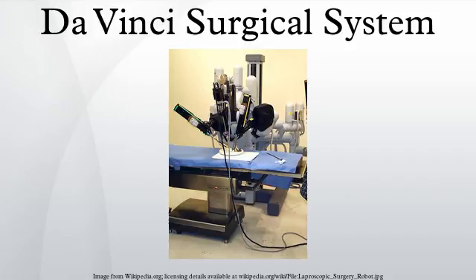Future applications. Although the general term robotic surgery is often used to refer to the technology, this term can give the impression that the Da Vinci system is performing the surgery autonomously. In contrast, the current Da Vinci surgical system cannot in any manner function on its own, as it was not designed as an autonomous system and lacks decision-making software. Instead, it relies on a human operator for all input.